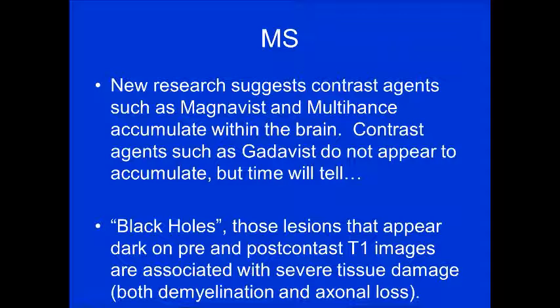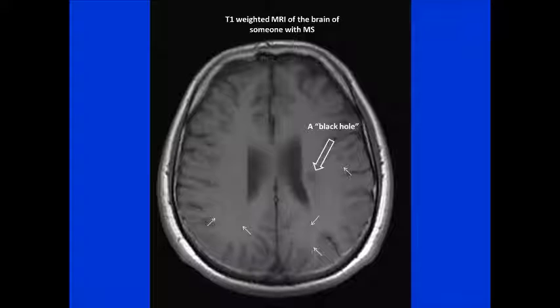Black holes are seen on T1 images — they appear dark on pre- and post-contrast T1 images and are associated with severe tissue loss involving both demyelination and axonal loss. When you see black holes, that's advanced multiple sclerosis. On this axial T1-weighted MRI of a patient with MS, the large arrow points to a black hole — it's simply dark, representing axonal loss.